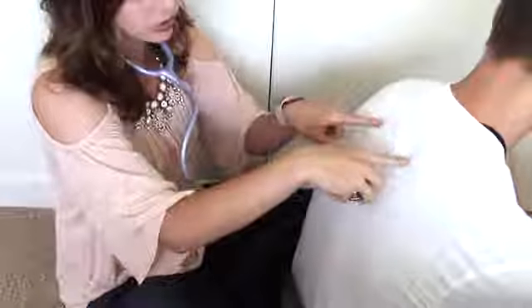I do the top 2, I do middle 2, and then I do bottom 2 at their bases kind of down here. You can obviously listen more. You can do as many spots as you want, but basically I'm listening to top lobes, middle lobes, and then their bottom lobes.